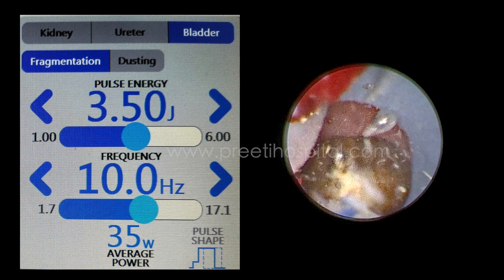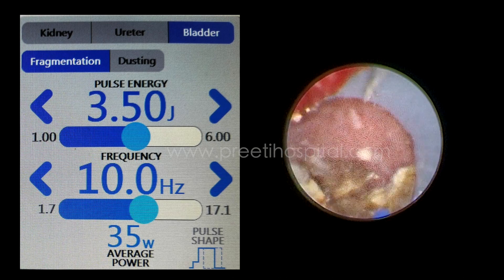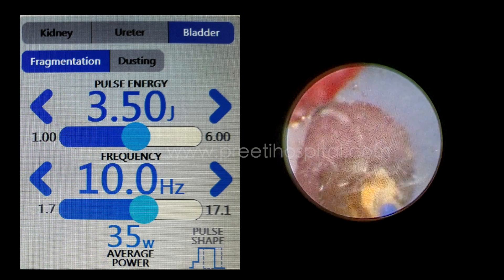It breaks exactly in the center — it does not do much powder. See, it is broken in the center, again broken in the center. It is exactly like a pneumatic lithotriptor.